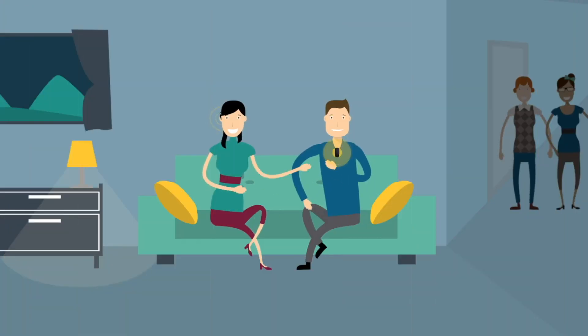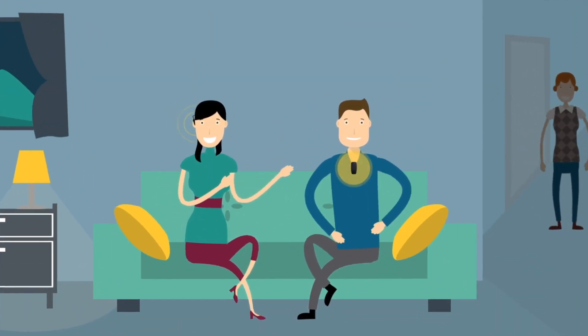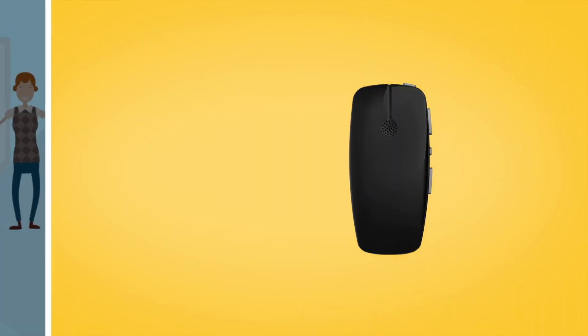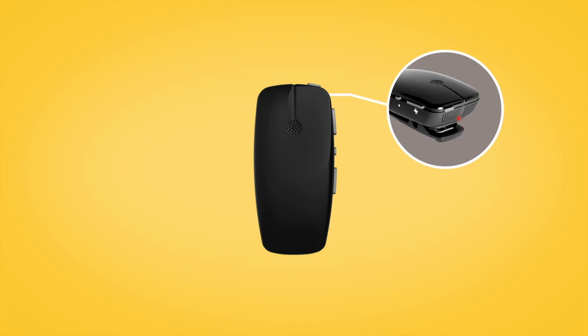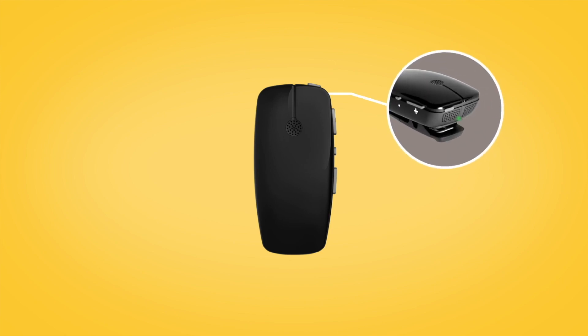A Cochlear Wireless Mini Microphone can help you to hear better over a distance and in noisy listening situations. While charging, the LED on top of the Mini Microphone lights red. When fully charged, it lights green with red flashes every two seconds.